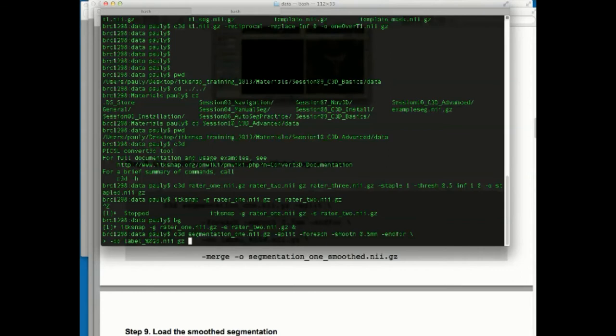So what it's basically going to do is write out 10 files, or 11 files in this case, I think, that are going to be called label underscore 00, label underscore 01, 02, like that. And as with any other output commands like the -O or this one, it's not actually going to touch the stack. It's just going to output them.